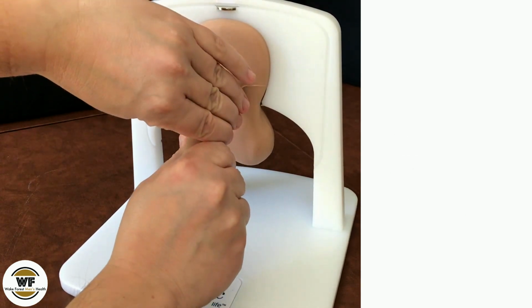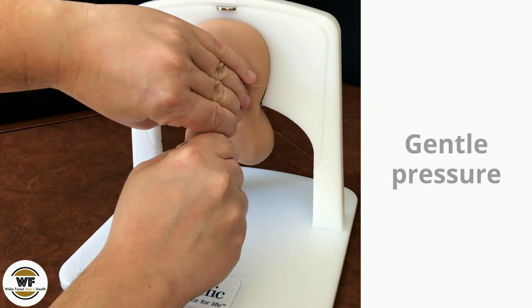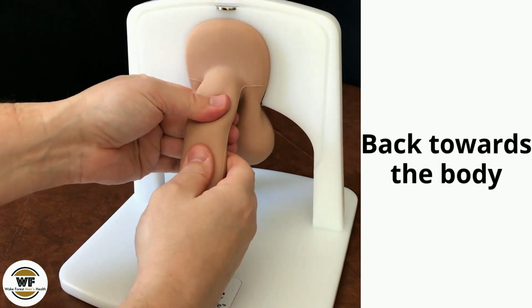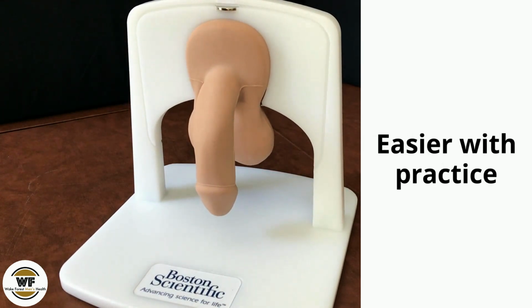This often allows for greater comfort and ease of urination. Gentle pressure near the end of the penis is maintained as the cylinders are compressed from the sides while working back towards the body. As with most things, this will get easier with practice.